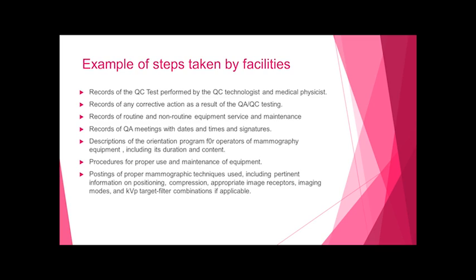Posting of proper mammographic techniques, including pertinent information on positioning, compression, appropriate image receptors, different imaging modes like auto KVP, auto time, manual, KVP target filter combinations if applicable, and breast implants. So that's what they want to see with that.